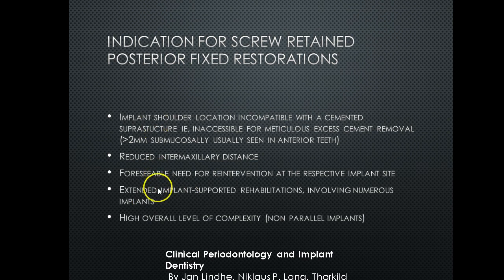Also, one of the indications is an extended implant-supported rehab involving numerous implants. That helps too, because then you can individually tie your implants up. Also, a high overall level of complexity, non-parallel implants. So in cases, especially when we're talking about teeth in a day or all-on-four, where you're using multiple implants and some are angulated due to anatomical considerations, screw-retained becomes a nice choice of restoration.